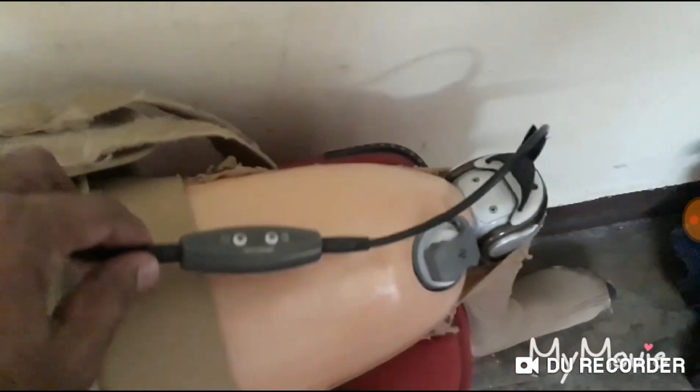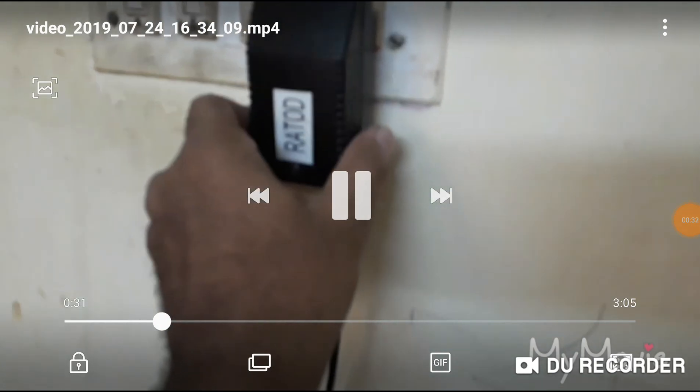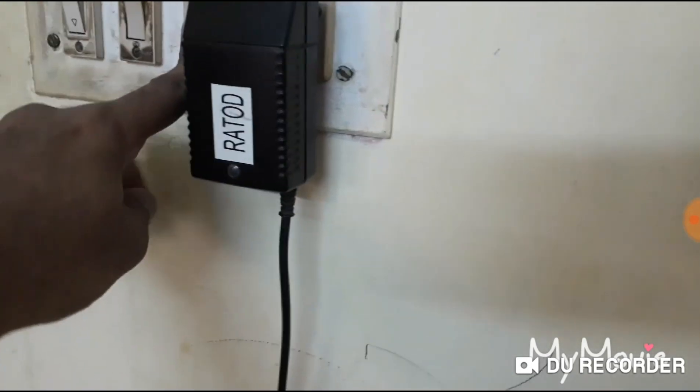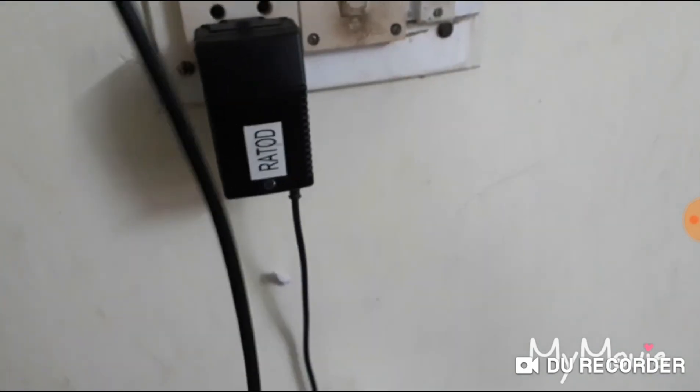Good evening friends. In this video I will show you what will happen to your C-Leg when it is completely discharged or your charger is not working. Today morning I found that my charger is not working. I checked all the points where any looseness is there — you can see this is a C-Leg and it is not getting charged at all. I checked in another point but there also it is not working, so it is completely dead.